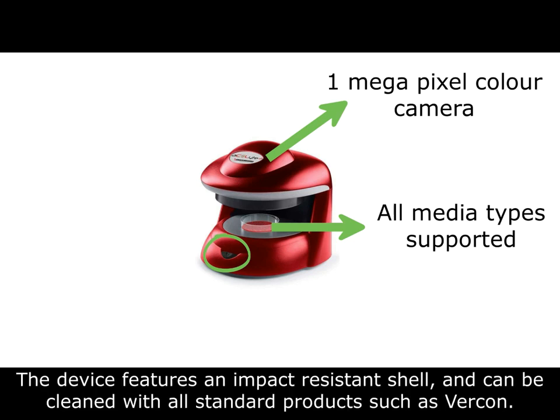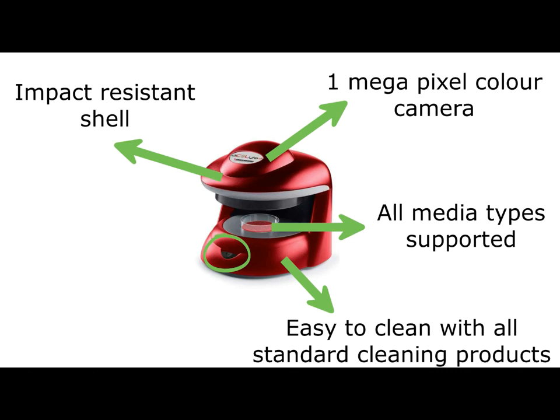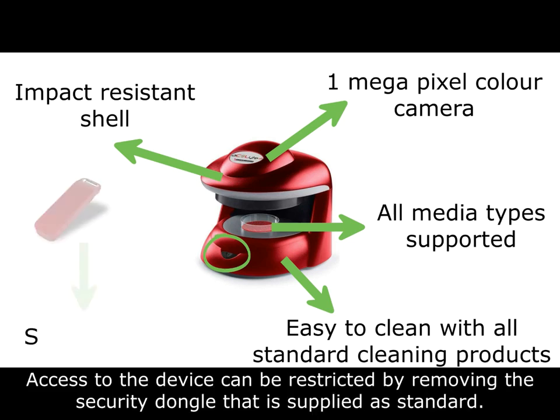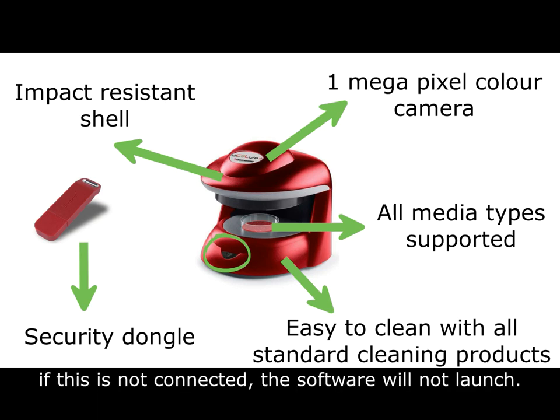The device features an impact-resistant shell and can be cleaned with all standard products such as Virkon. Access to the device can be restricted by removing the security dongle that is supplied as standard. If this is not connected, the software will not launch.